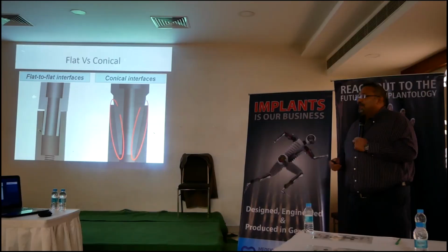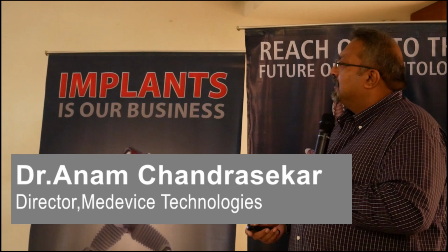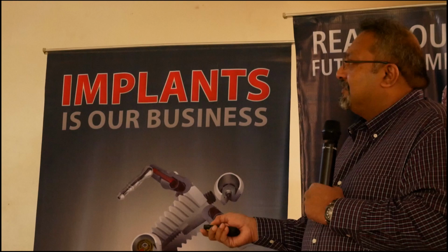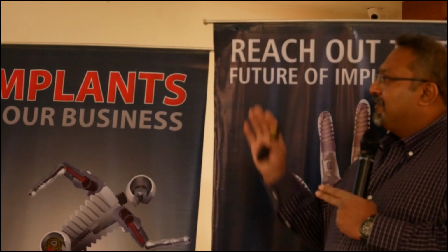Now it has gone inside nicely. It is in close contact with the inner surface of the implant, and when there is a force, there is hardly any movement. Right? There is no micro gap, no movement. So we want something else, right? You have to shift from an implant system which has a flat to flat connection to a conical connection. So number one, we said we need to do a platform switch. Number two, go for an implant which has a conical connection.